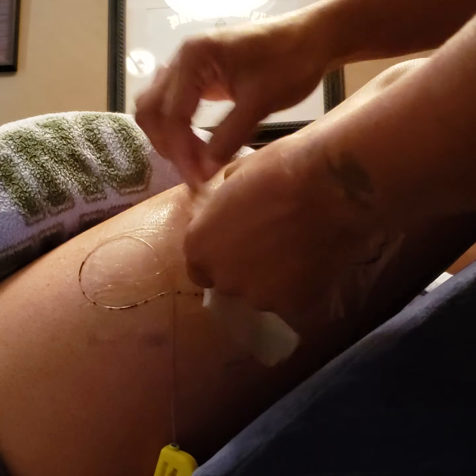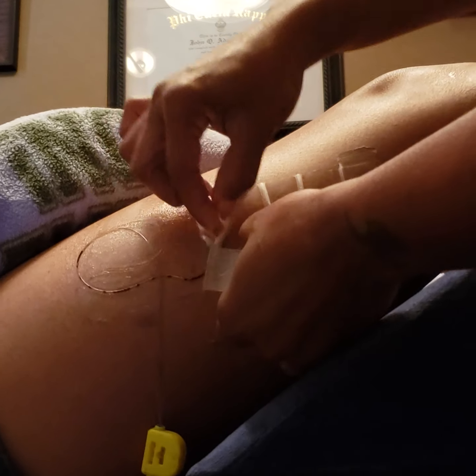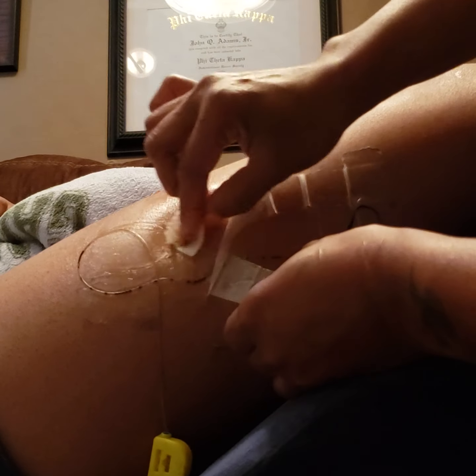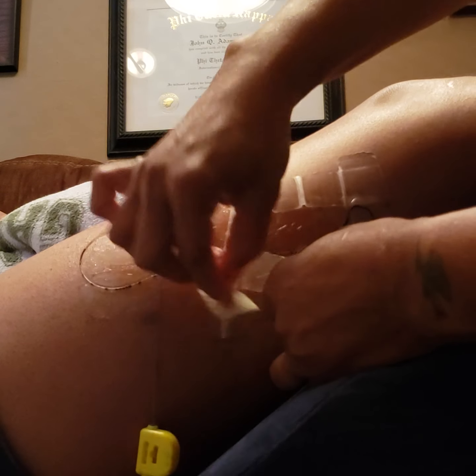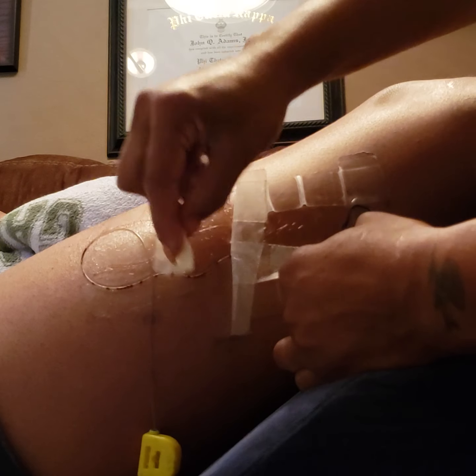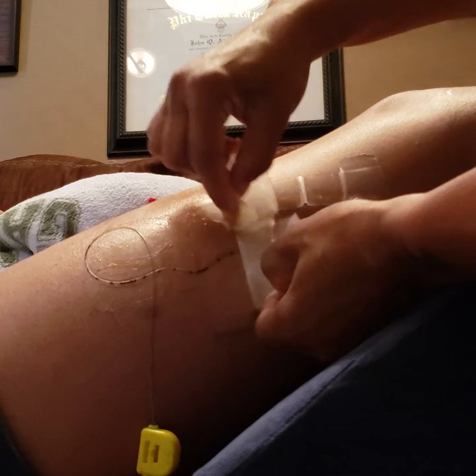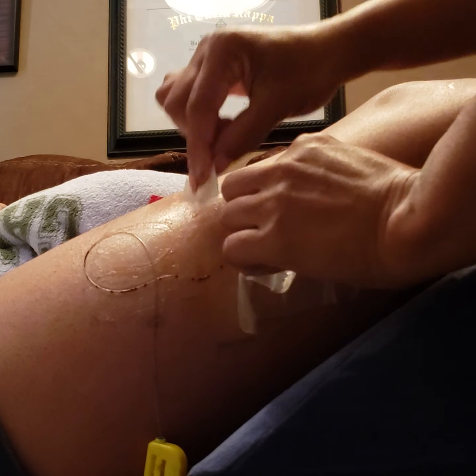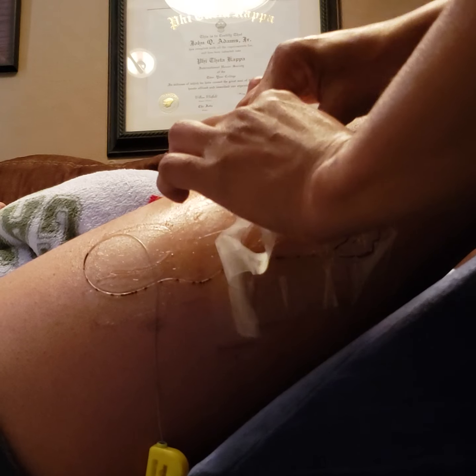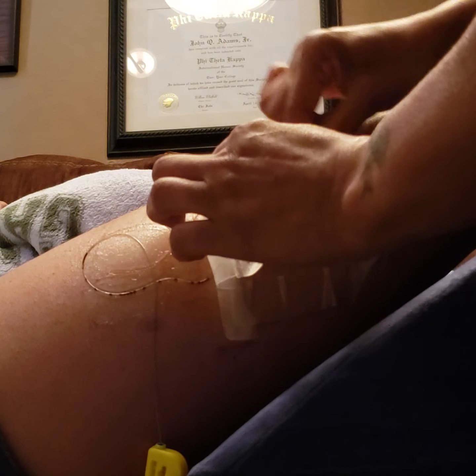Once you get to the point where you're removing the catheter, there should be a gold or black tip on the end of the catheter once it's removed, and you can just discard it right in the trash. They put a lot of tape on here — I guess to secure the catheter.